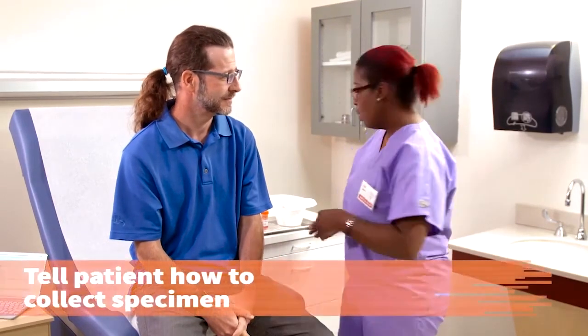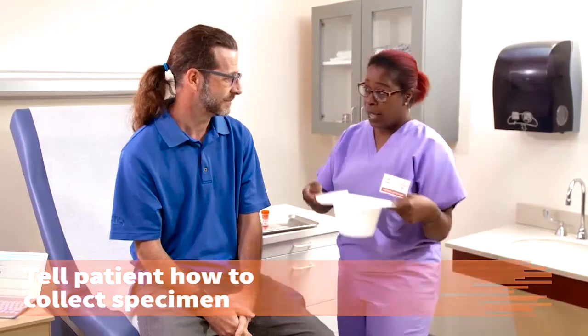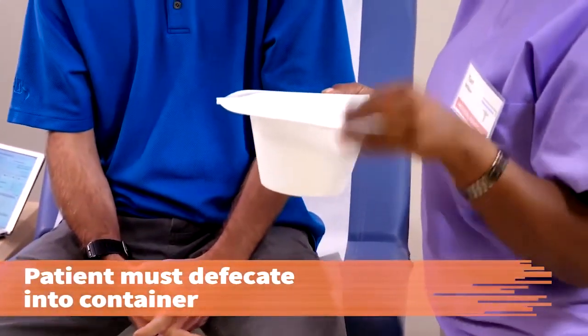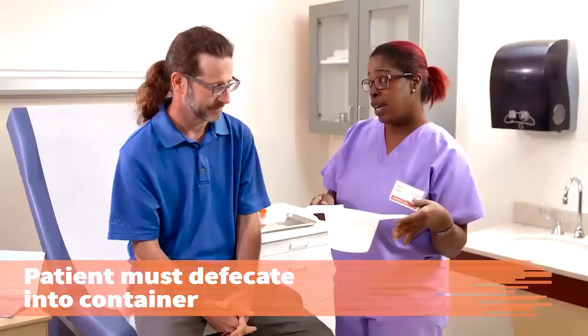Tell the patient how to collect the specimen. I'm going to give you a hat. This is what you'll collect the stool sample in. You're going to sit this on the toilet. The patient must defecate into the container provided. Stool cannot be retrieved from the toilet bowl. Do not defecate in the toilet and get the sample from there. It has to come into the hat, okay?